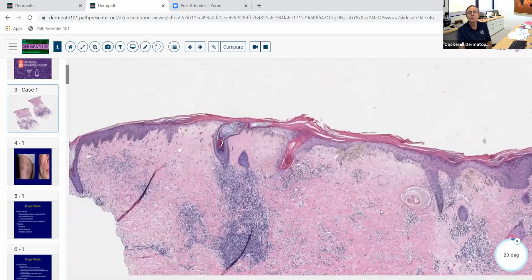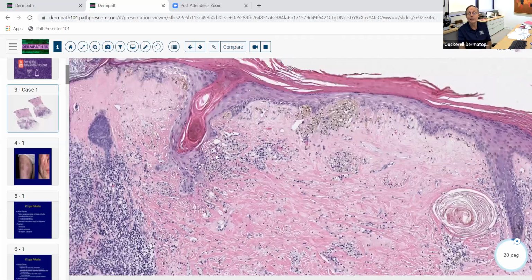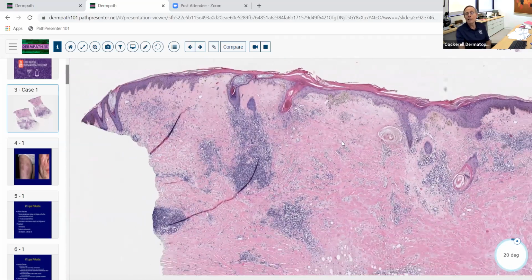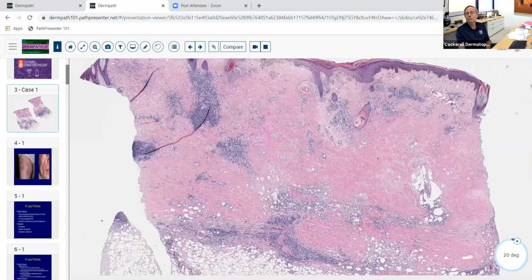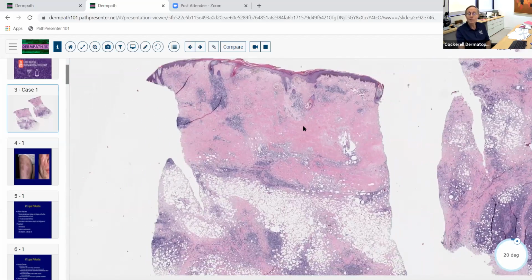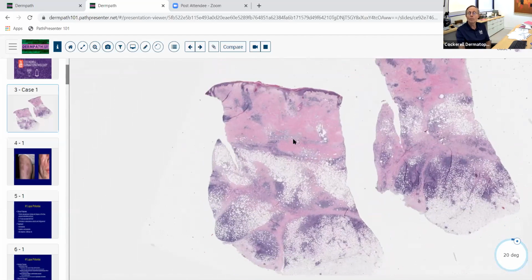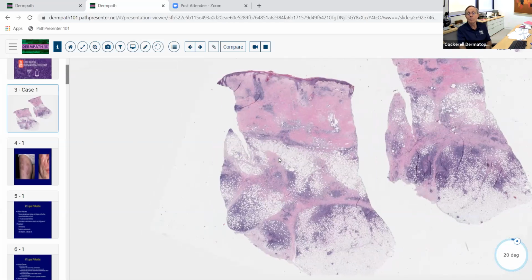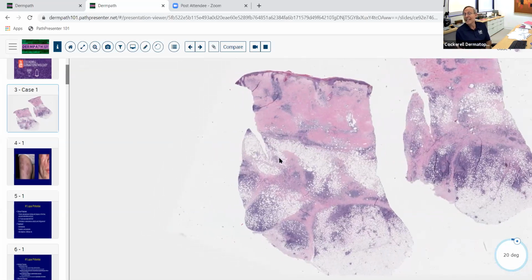Okay, this other side also. This one's got a follicular plug in here of the overlying discoid LE. Now, why do you see discoid LE in lupus profundus commonly? Well, number one, interestingly enough, it's the most common form of panniculitis in the upper part of the body. The arms, the face. You'll biopsy people that have discoid LE of the scalp. If you get a deep enough biopsy, you'll often see some evidence of subcutaneous involvement there as well. So LE profundus is the most common panniculitis of the face.